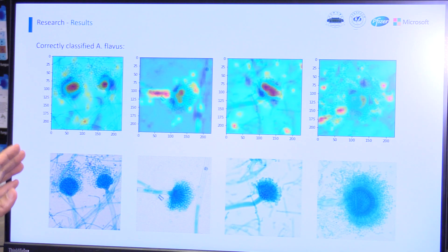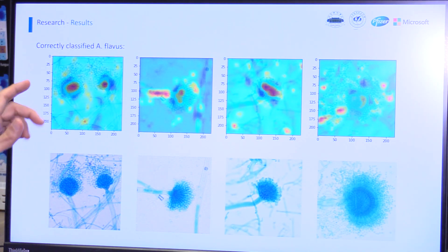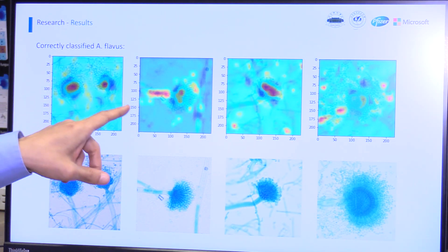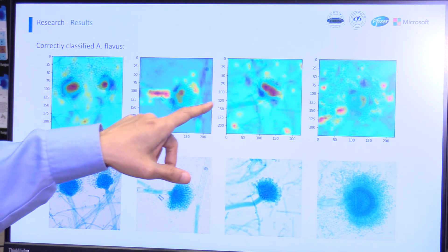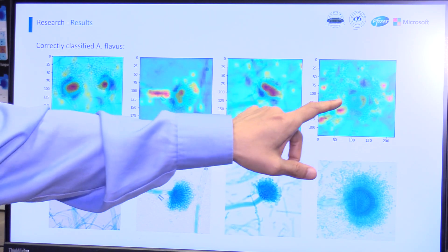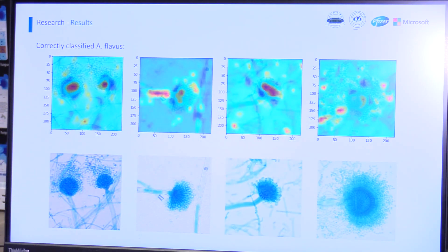This is another type of fungal infection. You can see that the system is also extracting all the features that the doctors will be looking at.